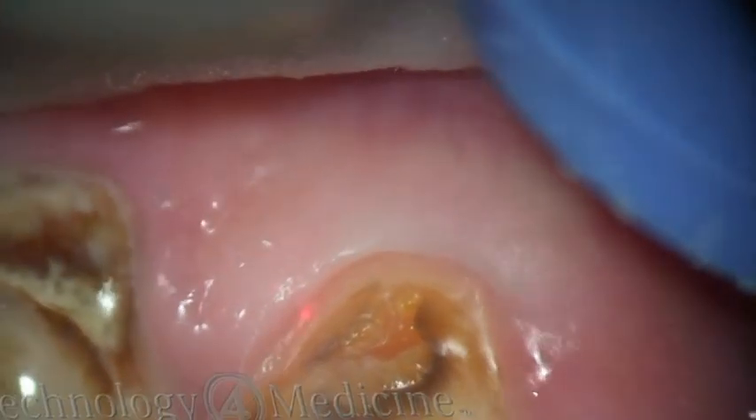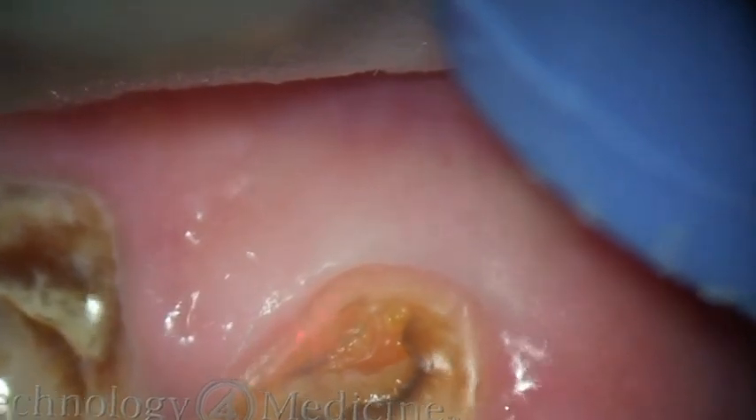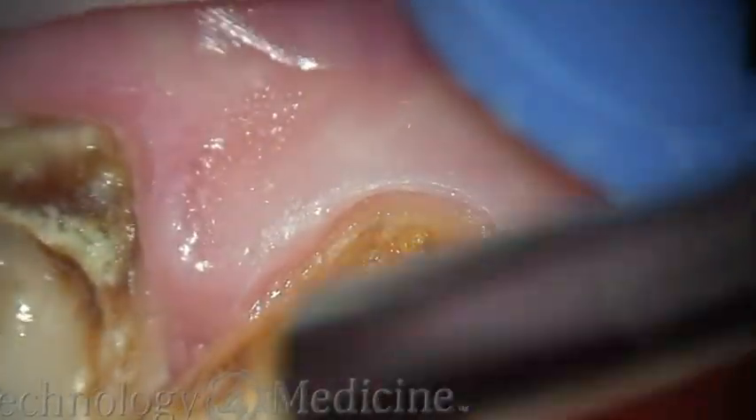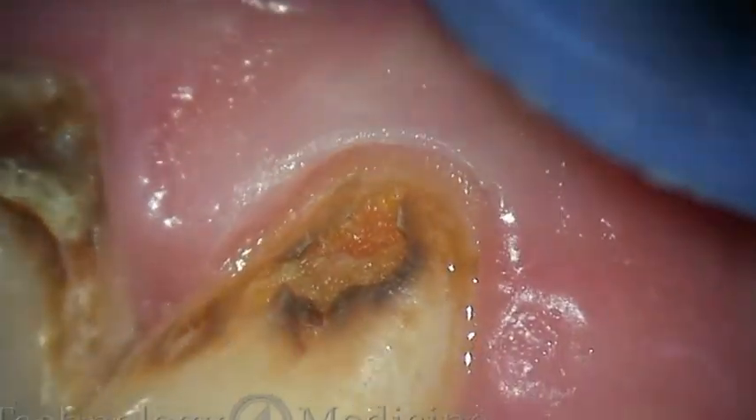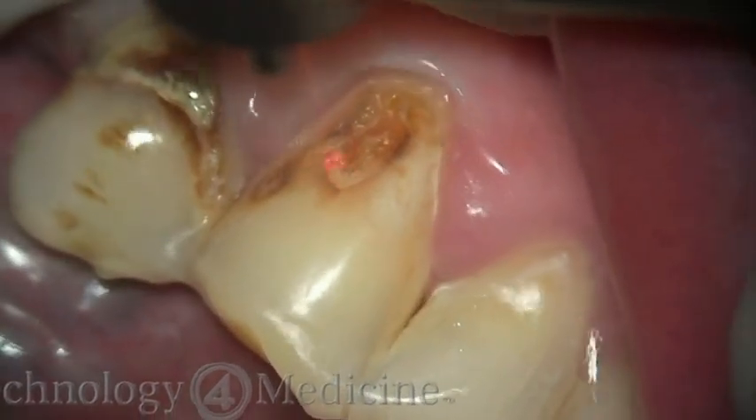I hardly ever use a topical or local anesthetic when I'm performing these procedures. You just don't need to with the 1000 microsecond pulse duration. You can see I have a nice heme-free field.